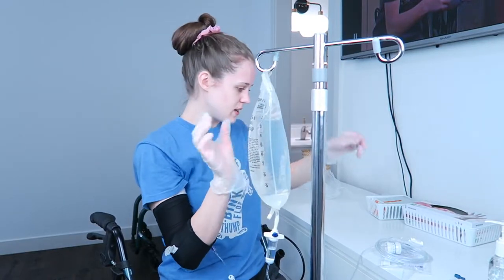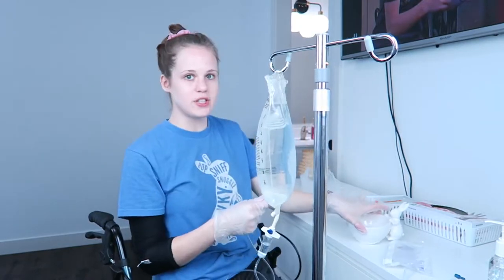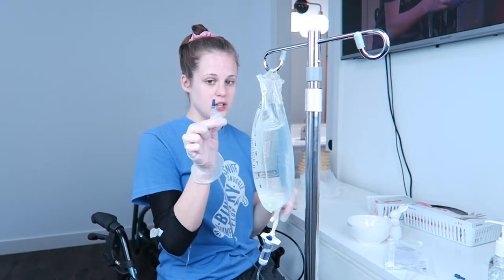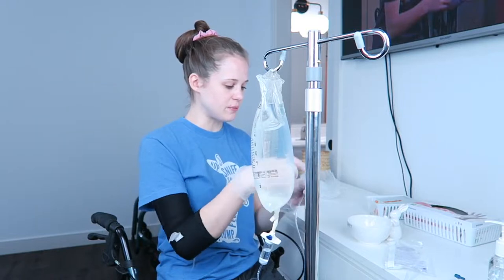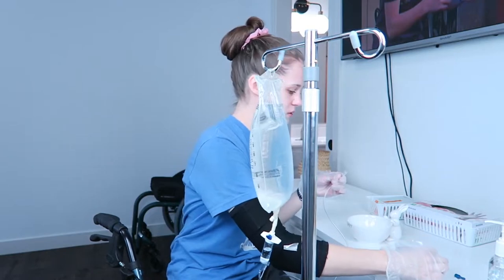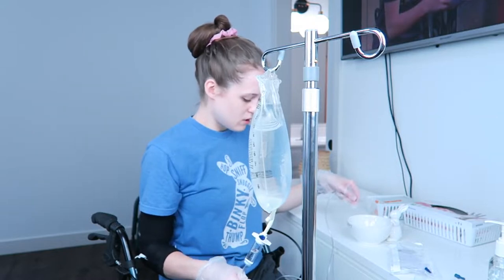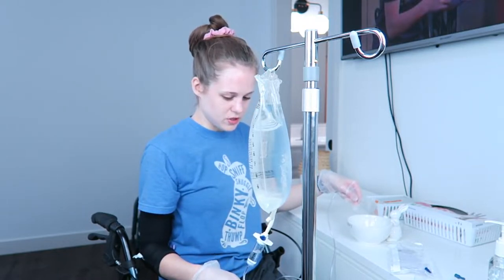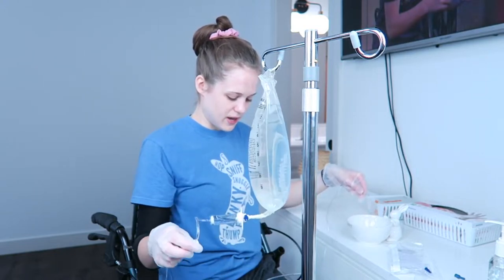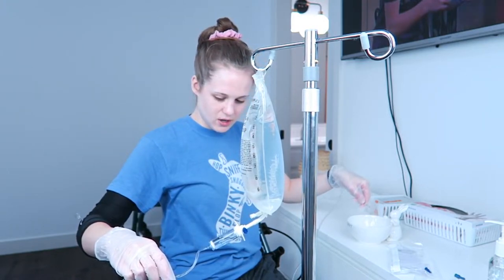Just like that. And then I'm gonna take the tubing in my hand. So I have a little dish here. It's not a sterile dish, so I'm not gonna be touching it to the end of this, but what I'm gonna do is take this cap off, set the cap down, unclamp the tubing, and my infusion is running full wide open right now, so it is running pretty fast. So I'm just priming the tubing here, which basically means getting all the air out.